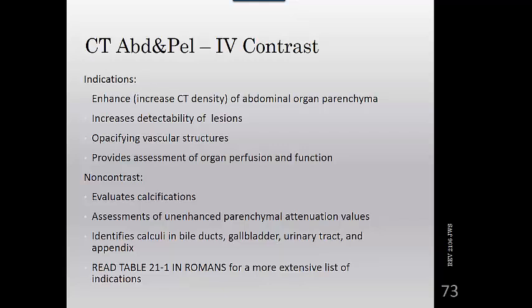Another aspect of abdominal scanning is multiphasic imaging that's frequently used for specialized studies of the pancreas, the liver, and the kidneys, as well as the many abdominal CTA protocols. We'll be talking about all these a little later. The factors that should be considered in determining appropriate injection protocols for these studies are the same as for the other areas of the body, which are contrast medium injection duration, the contrast arrival time, and the scan duration.